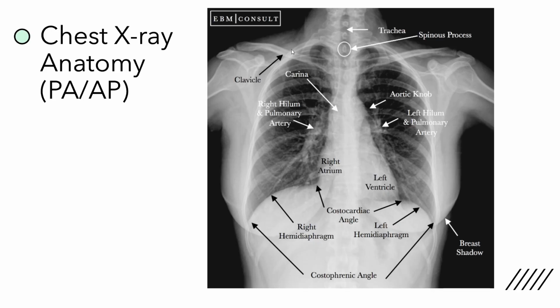We could trace that rib all the way around. It gets a little confusing though when we get into the anterior aspect as to which rib is what. So as long as you can count those posterior aspects of the ribs, it's probably easiest to do it that way. We can also do the same on the other side. We can count 1, 2, 3, 4, 5, 6, 7, 8, 9, and 10. So that's perfect.